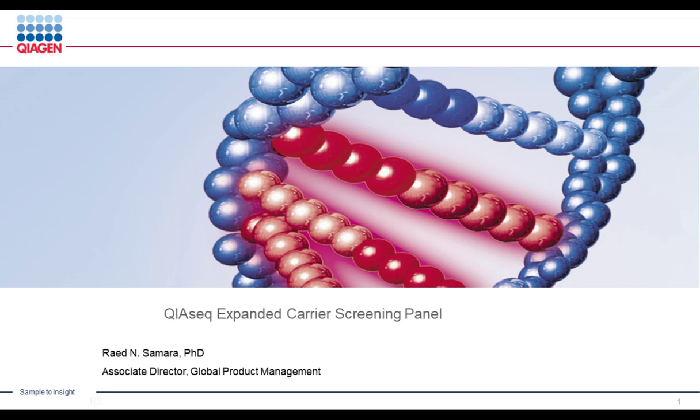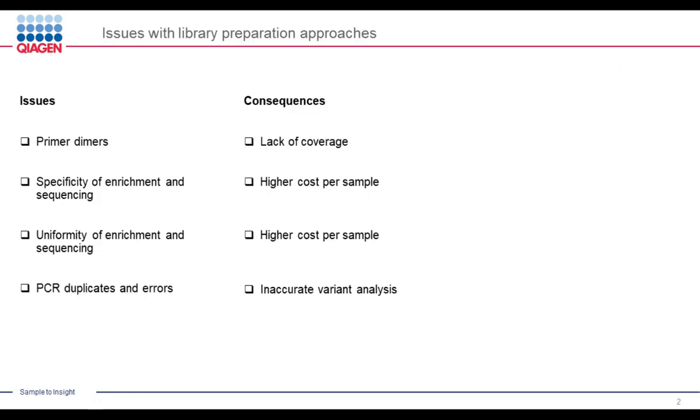This presentation will be broken into two pieces. I will go through the chemistry part of the panel, and then Rupert will jump in to speak about the bioinformatics piece. And to start off for the chemistry part, I thought we would start off with the issues that we commonly see in library preparation approaches.